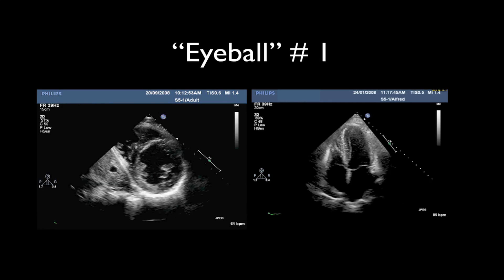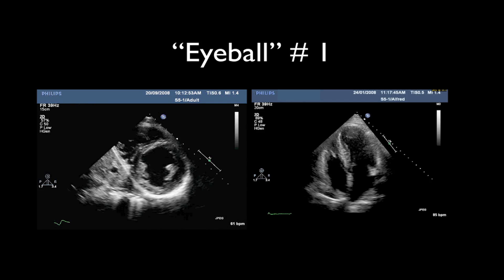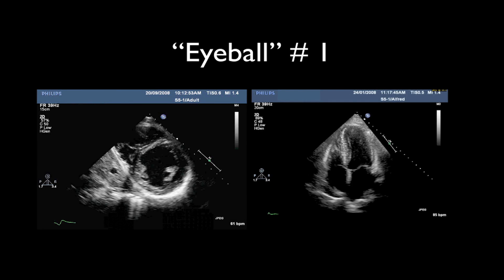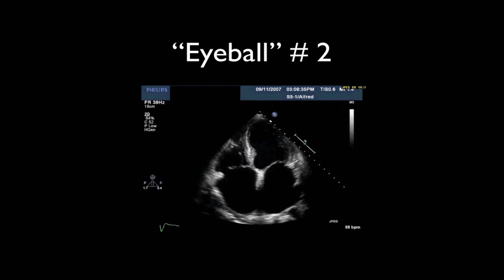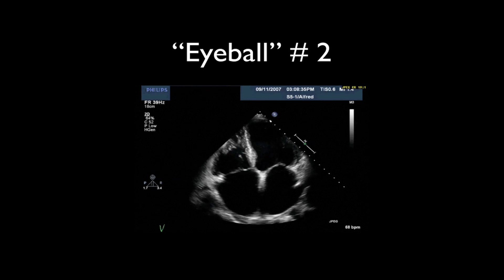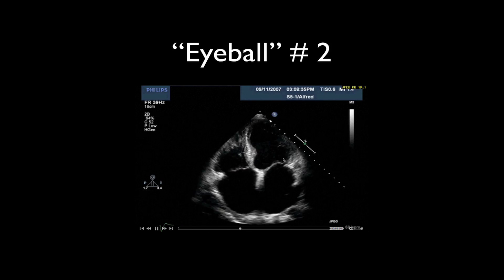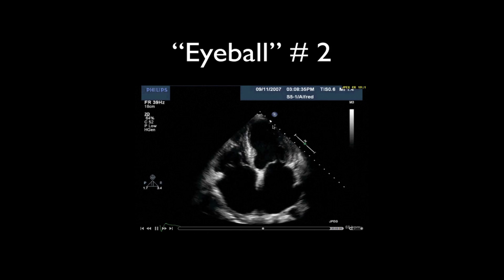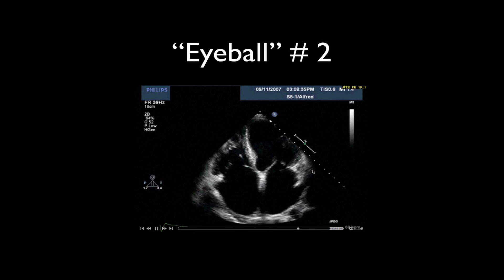Eyeball test example one: most people, even without specific training in global LV systolic function assessment, correctly categorise this as a normal left ventricle. Example two: nearly everyone seeing this will say this is not good — and indeed, this represents a severe dilated cardiomyopathy. Note the centimetre markings along the right-hand side. It is severely dilated, with barely any movement; the mitral valve is barely puffing open, there is hardly any thickening of the walls, and the basal septum is preserved only slightly better. This is a ventricle with an ejection fraction of 15%.